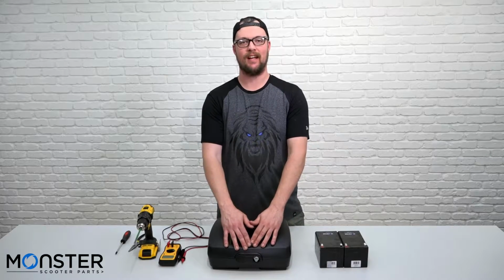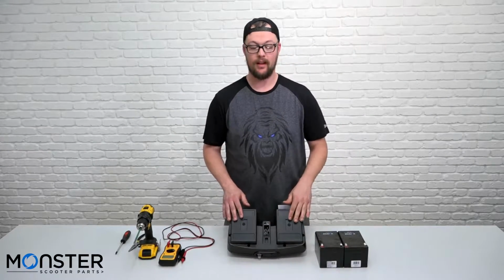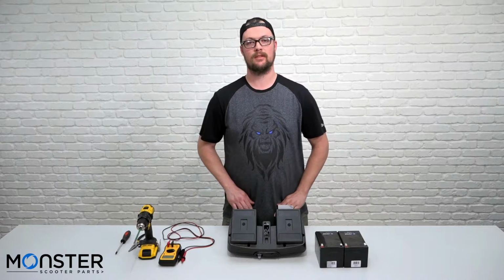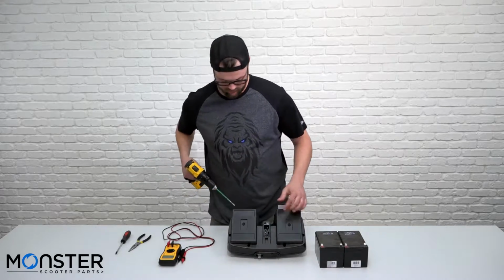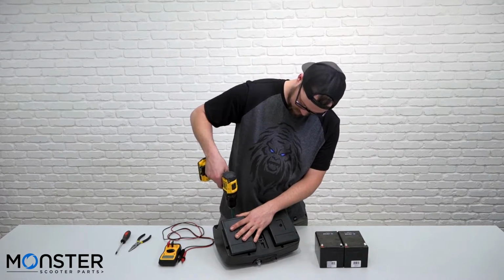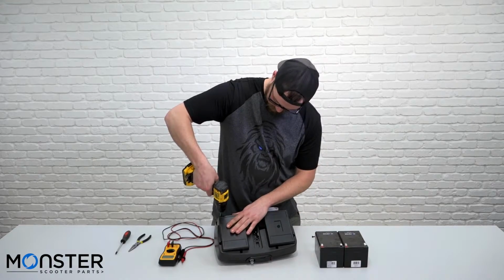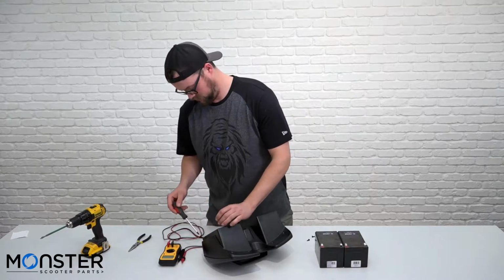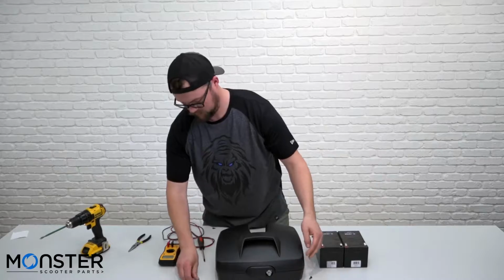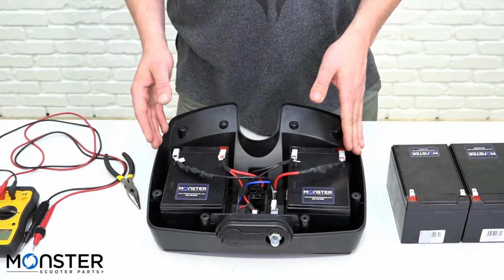To begin, we'll be removing the 8 Phillips head screws from the outside of the box from underneath. Making sure that it is the 8 outside screws and not the 2 inside ones. Now that we've got our 8 screws out, go ahead and take that lid off. We can start disconnecting our battery.